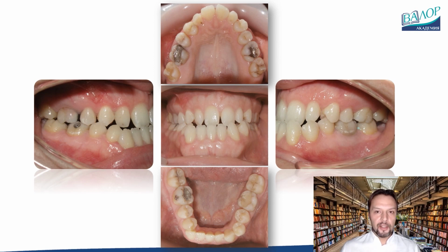Severe Class 3 occlusion and crossbite of frontal teeth. Bolton discrepancy with microdontic lateral incisors and medialization of maxillary left teeth. Because of the missing lower incisor, an ideal Class 1 occlusion can be achieved for the maxillary premolars, which are going to replace canines at the end of treatment by placing lower right canine at the place of a lower incisor. Microdontic lateral incisor is among the main causes of retention of maxillary canine, as you will find out in another episode of my series.